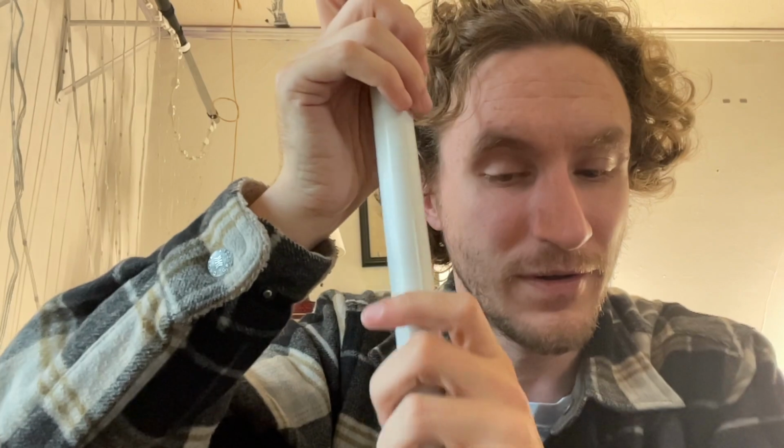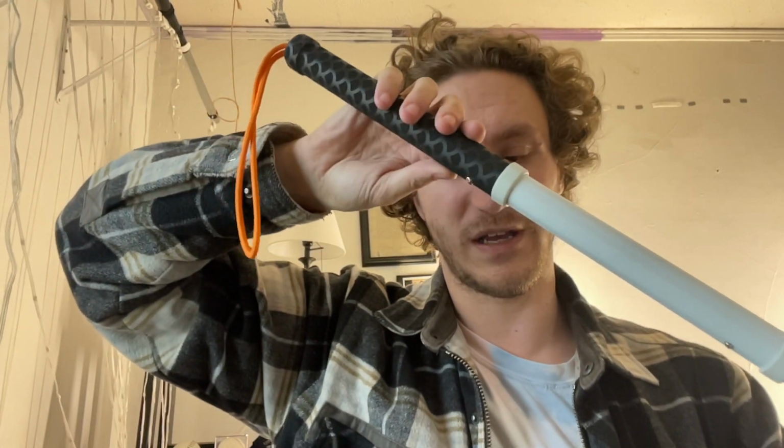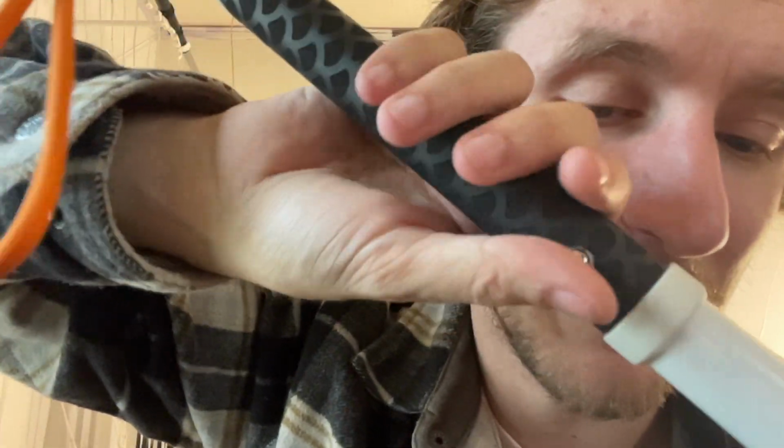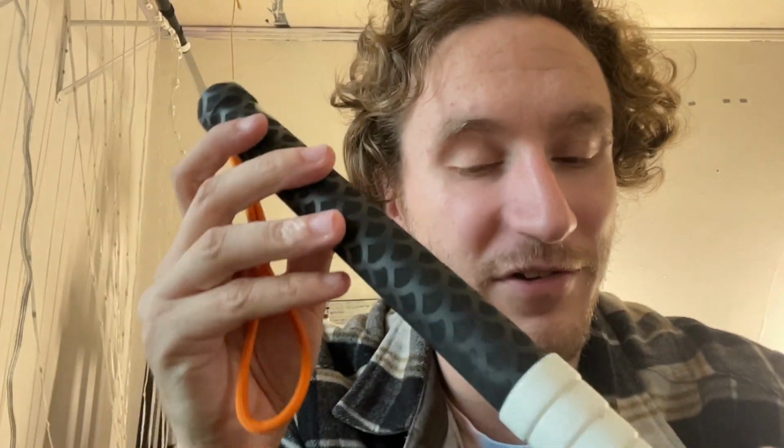So at every section, you're hearing clicks as each one goes down. Now, I can put this cane down, and I could potentially, I don't want to break it, but I could almost lean on it, and I can push it pretty hard into the floor, and it is not going anywhere. This cane is relatively lightweight and will not collapse until I choose to allow it to do so by coming back up to the grip section, pushing this button, and doing one of my favorite things. You ready? I'm going to try to get this all in frame, or as close as I can get. How about that? It just clicks all back into one unit.